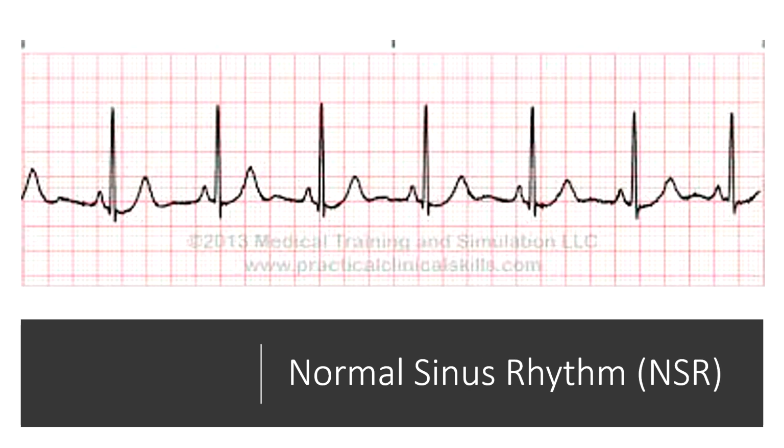So here we're looking at a rhythm that is normal sinus rhythm. Looking at our first QRS, our first complex, we see a P wave, then we see that upward spike and a downward spike, that's our QRS, and then we see another waveform, and that's our T. So we should have a P, a QRS, and then that T interval. If we count the QRS complexes, 1, 2, 3, 4, 5, 6, 7, 7 times 10 would be 70.